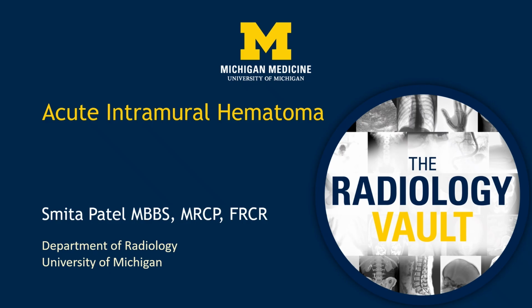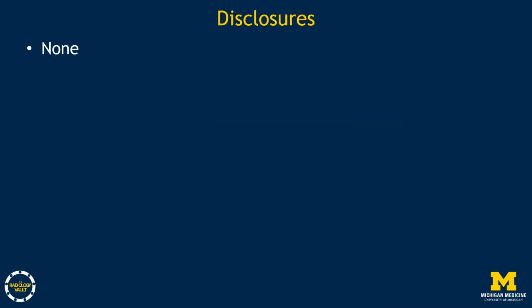My name is Smita Patel. I'm a cardiothoracic radiologist, and I'm going to be talking on acute intramural hematoma, which is a well-recognized cause of acute aortic syndrome that is important to accurately diagnose, as this helps guide prompt management of this life-threatening emergency. I have no disclosures.